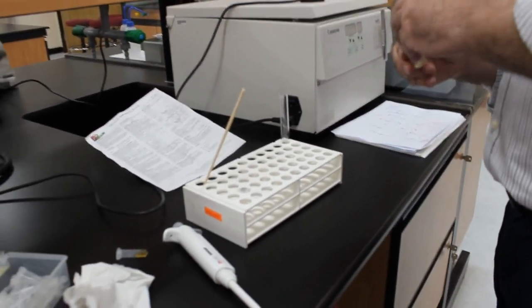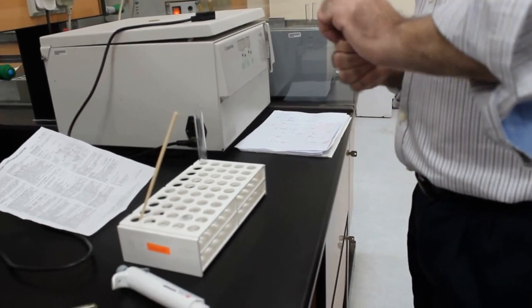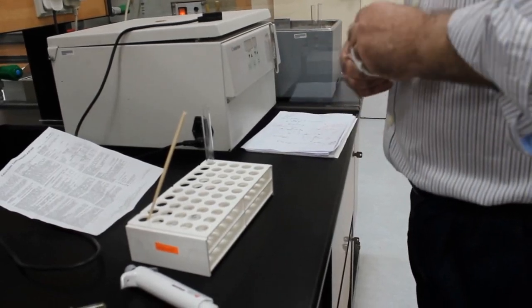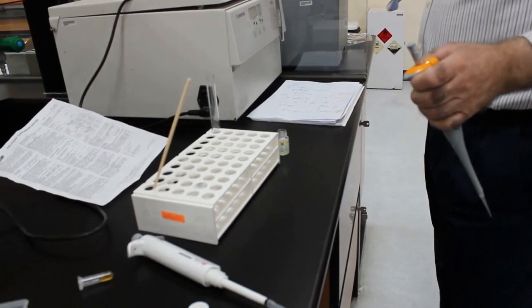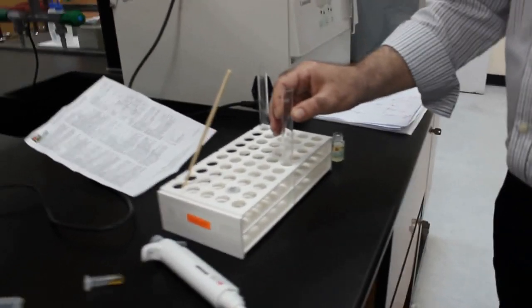Open the reagent after mixing it. This has been 2 minutes here.